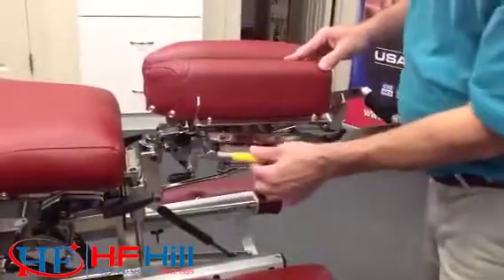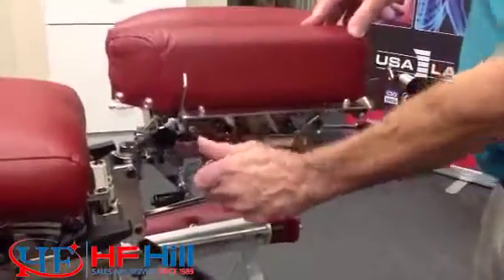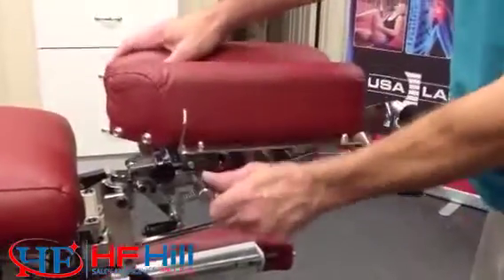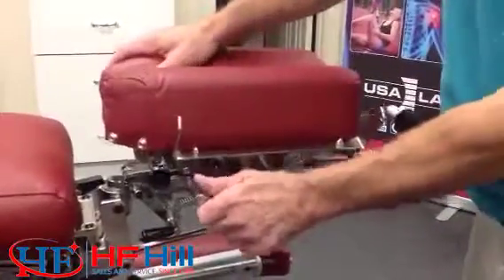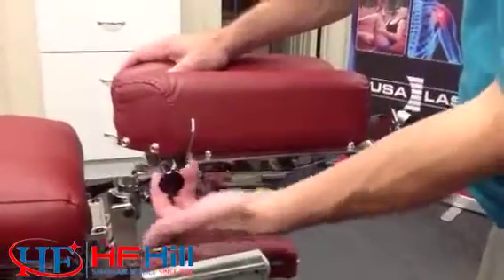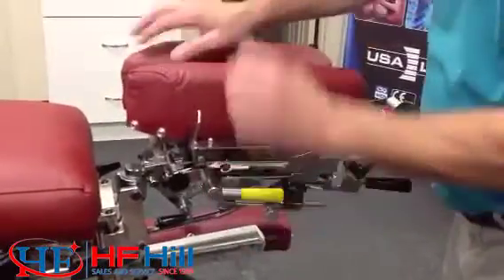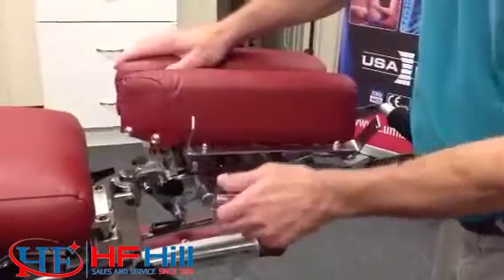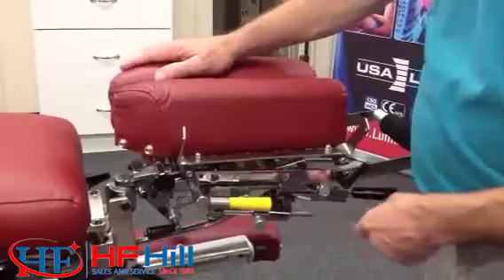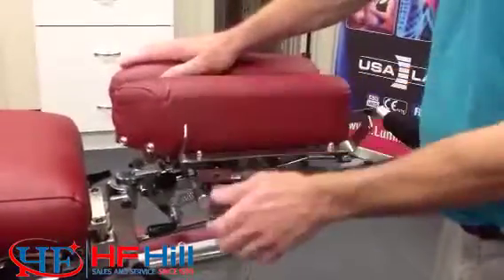Alright, so this yellow knob right here is your drop cocking knob. As we push down on the knob, the drop comes up. So this motion here is a forward motion drop. As we take this black handle and pull it out, when the drop is in the down position, it's now a toggle drop. Again, with the drop in the down position, push the knob in, and we go back to a forward motion drop.